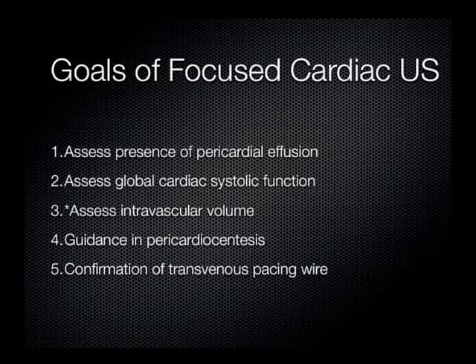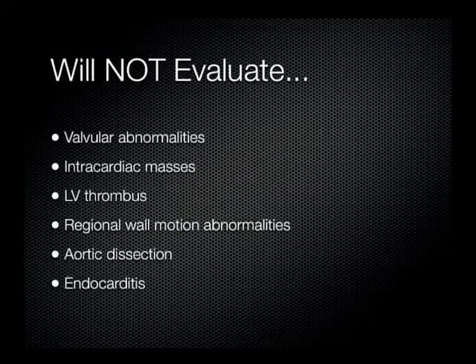The other goals are to assess for intravascular volume and to help with procedures that include pericardiocentesis and transvenous pacing. It's important to recognize the limitations of a focused cardiac ultrasound. It will not assess for valvular pathologies, masses, thrombosis, wall motion abnormalities, and is unable to reliably rule out aortic dissection or endocarditis. But with experience, you might be able to make some of these diagnoses as well.